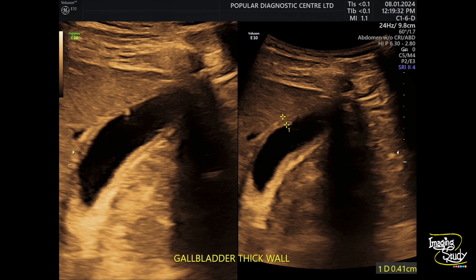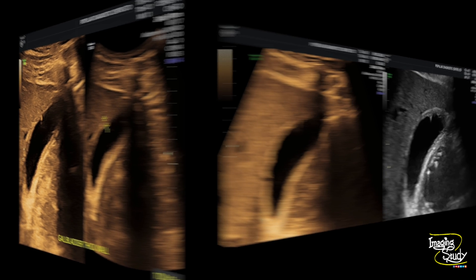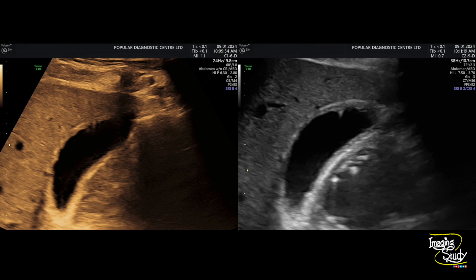Here's the measurement of the gallbladder wall which is more than three millimeters, so it's thickened. As this is a chronic case, the gallbladder wall is almost generalized thickened. Here's a picture with irregular thickening and comet-tail artifacts.